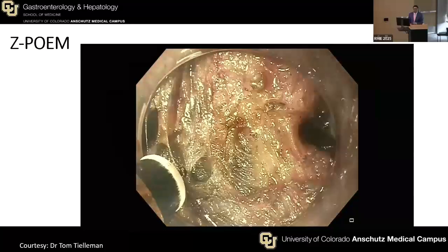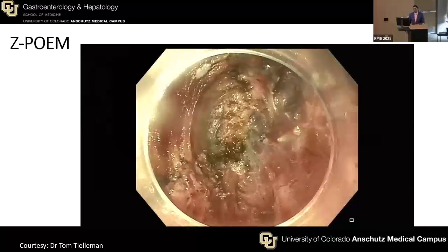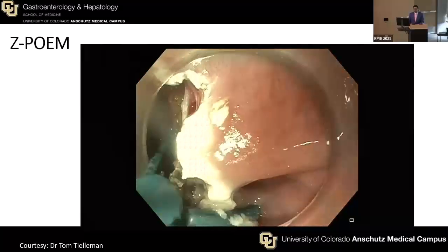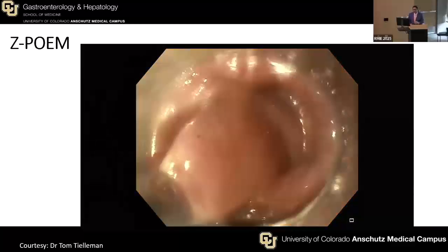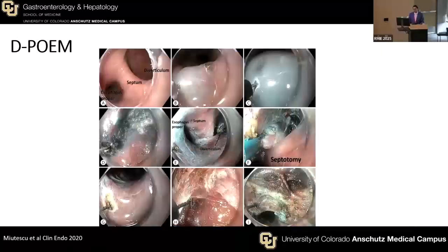And then the incision is small, so we like to use really short stem clips because it's pretty high up. And here you'll see that once this is done, he'll finish it up with a few clips. And same thing, some centers send the patient home. Some people do an esophagogram the same day to make sure before discharging the patient.